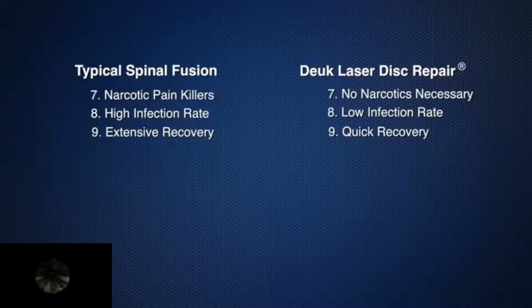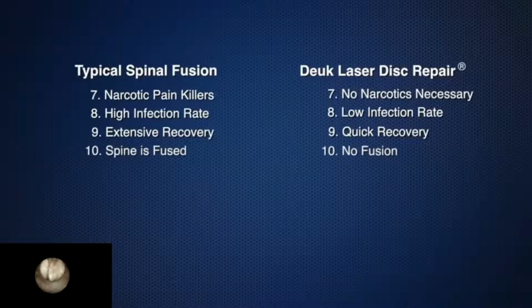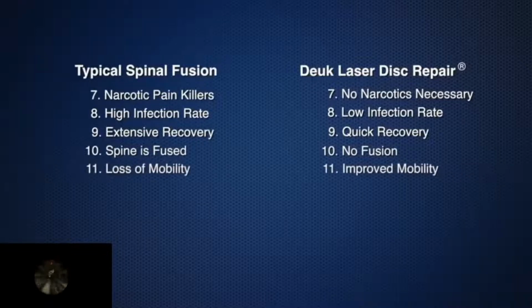Whereas the recovery from Deuk laser disc repair is in a matter of hours or days, rather than weeks or months. With fusion, the spine is being fused together, losing movement. Whereas there is no fusion with the Deuk laser disc repair. Normal movements of the joints in the spine is preserved. Spinal fusion results in loss of mobility. There is no mobility loss with the Deuk laser disc repair. In fact, most Deuk laser disc repair patients experience improved mobility after the surgery.